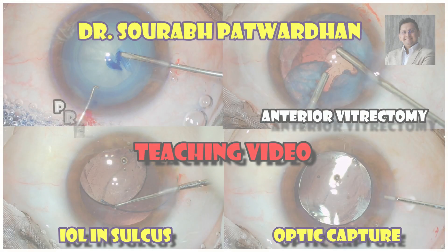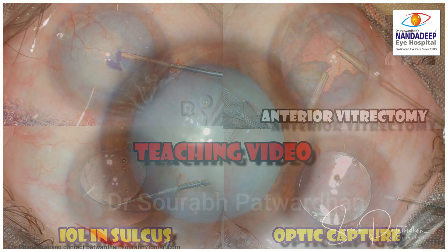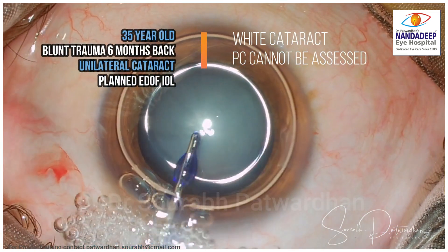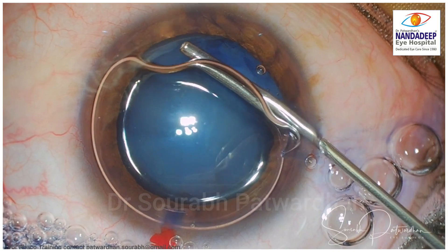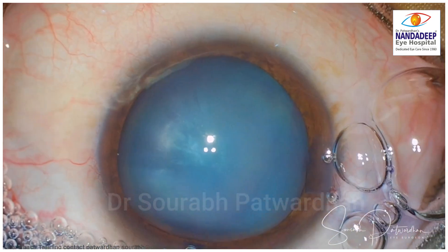In this video, I will be dealing with a case which had a pre-existing posterior capsule rupture. I will teach you how to do anterior vitrectomy in such a situation, as well as how to place the IOL in sulcus and when to do optic capture. This is a 35-year-old patient with blunt trauma 6 months back with unilateral cataract. EDOF IOL was planned in this case.